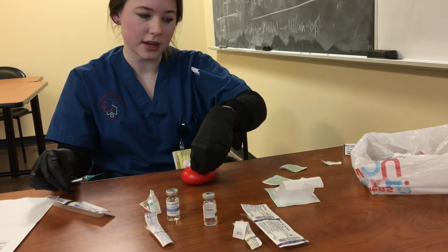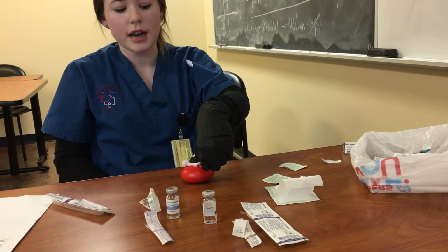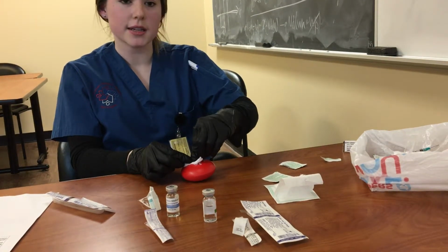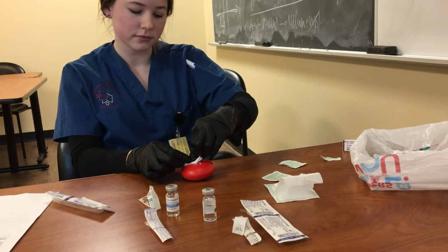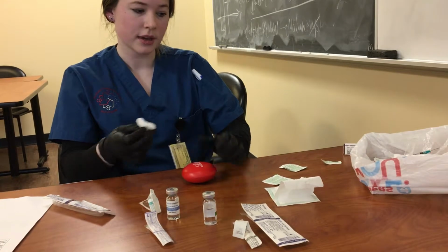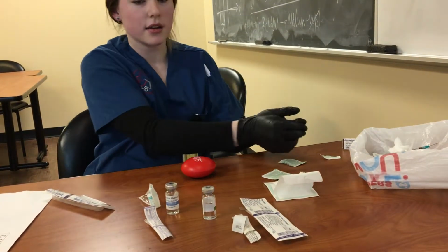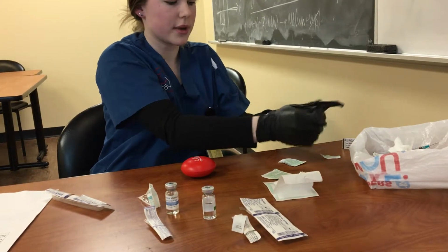And you never want to recap needles, so this will go directly into the sharps container. And because we did give heparin, I want to hold pressure for about 30 seconds to 1 minute. Perfect. And of course, I would document everything I give and have the patient ask me if he feels any discomfort or any issues after the medication has been given.